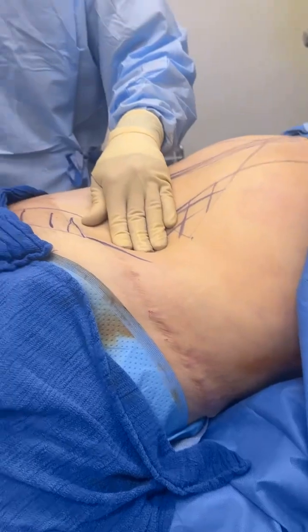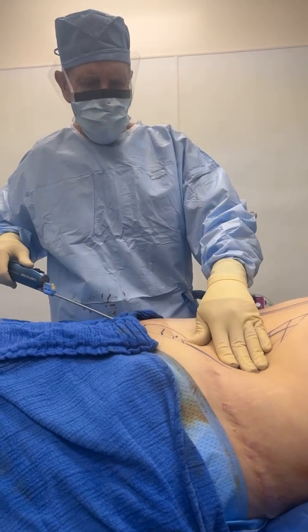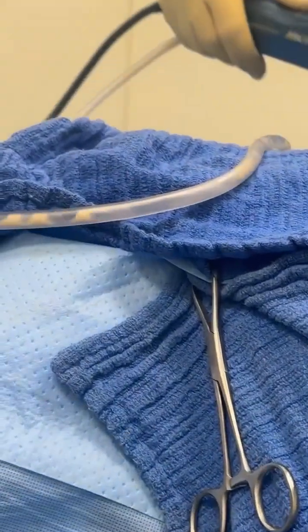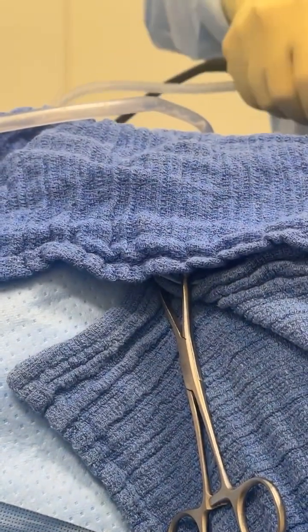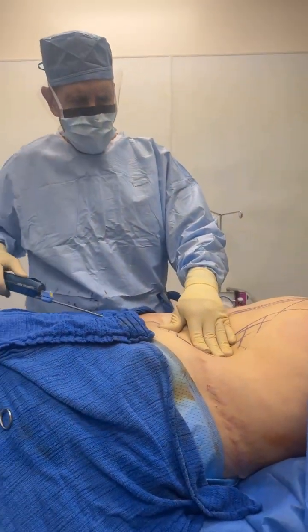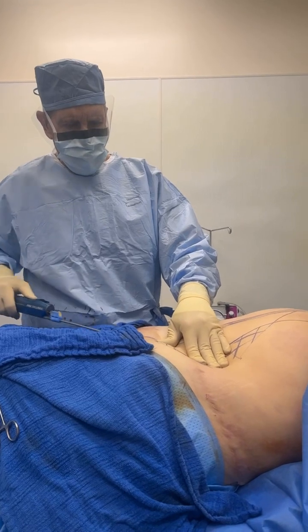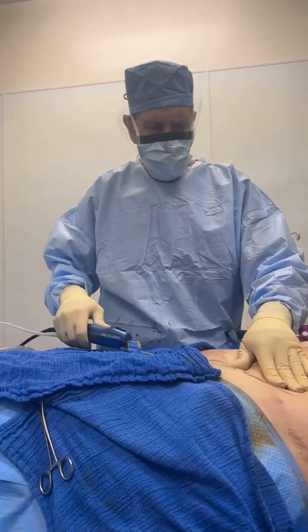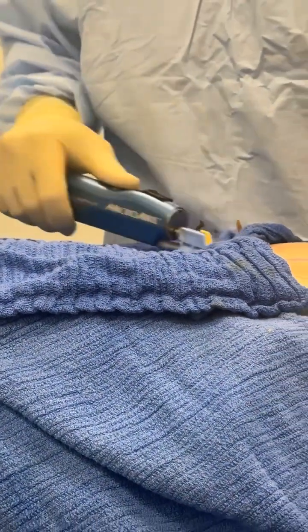Number four, my strokes are very slow and they're very calculated. This not only gives you this beautiful output, but also decreases the risk of intra-abdominal organ perforation, or if you're in the thoracic cavity, intrathoracic perforation, something that has never happened to us. When those things happen, it happens because the surgeon inadvertently gives an unintended stroke. It's like when you're driving too fast and you lose control, and the vehicle goes somewhere where you don't want it to go. Same thing happens here. So my strokes are very calculated, very slow, and much less risk of injuring internal organs.